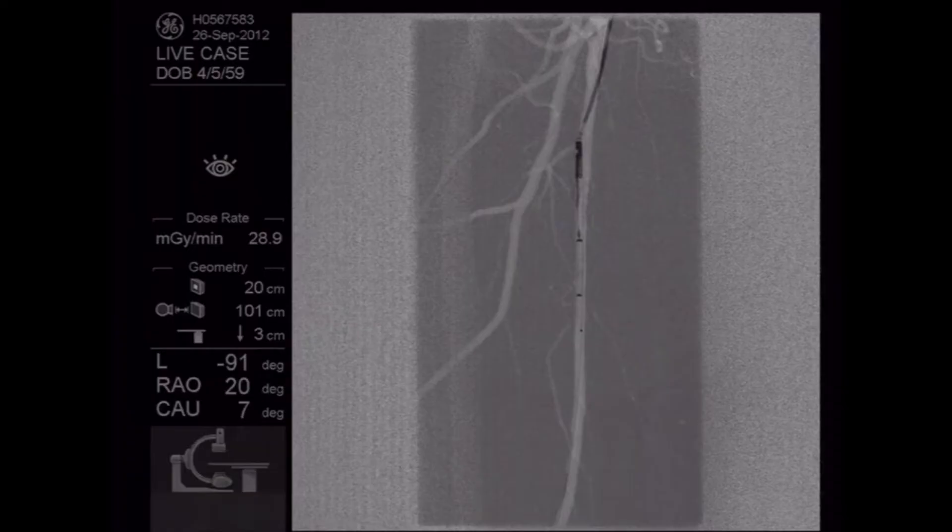In the area where we've got that little bit of residual narrowing, we'll go ahead and turn it on and make a pass or two through that area. All right, James, go ahead. You can see the change in the configuration of the little notch. You can actually hear the buzzing, too — that's the motor spinning the little cutting blade. We're going to bring it back and spin it around so we get the opposite side of the vessel.